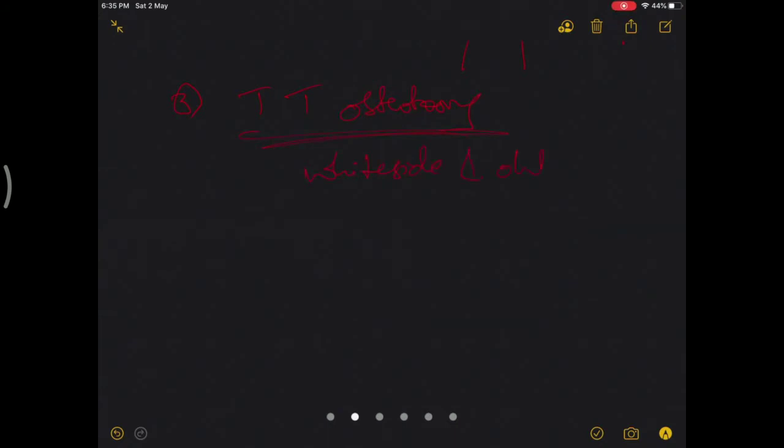What it is said is you have a patella, you have the patellar tendon, and you take around 8 to 10 centimeters of tibial tuberosity, the anterior crest of the tibia, and you don't dissect on the lateral or the anterior compartment of the proximal tibia, and you make a saw cut through and through, and you flip the entire thing on the lateral side.